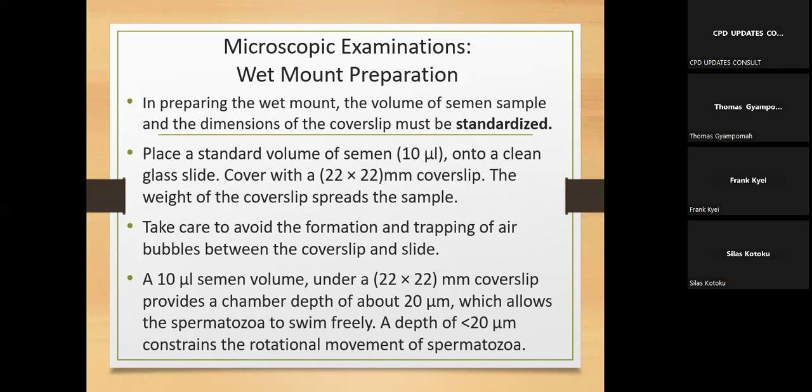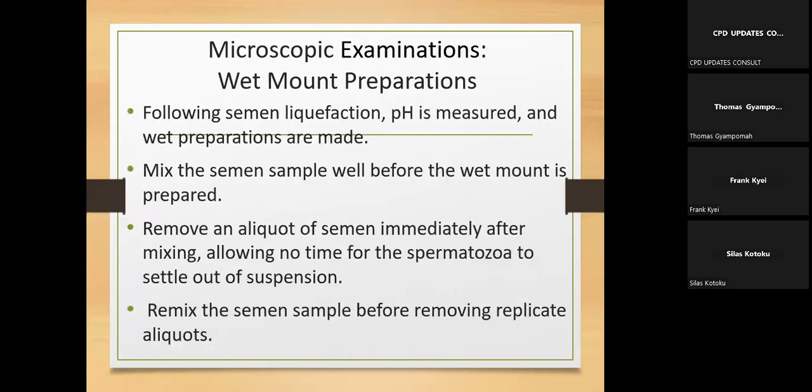How will you calculate that depth? Who can tell me? Yes, this is basic science. You have a 10 microliter drop of semen. You put it on a slide. You apply a 22 by 22 cover slip on it.